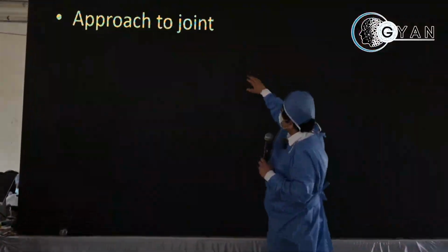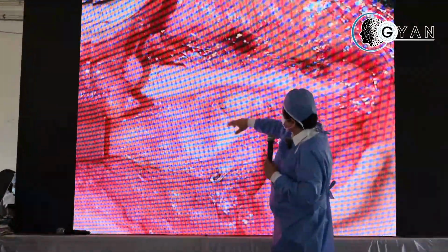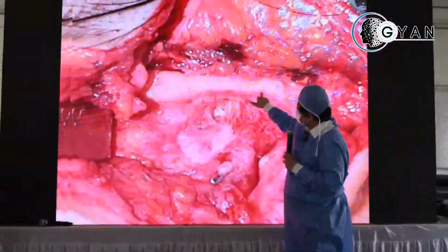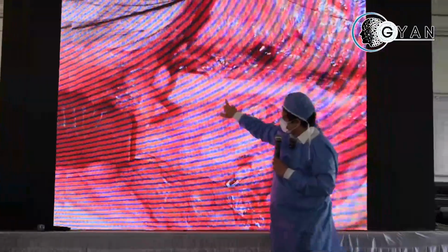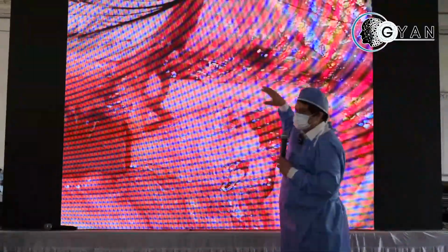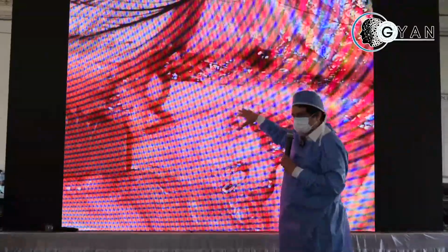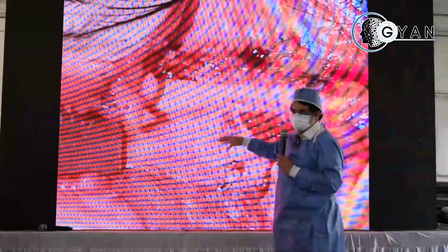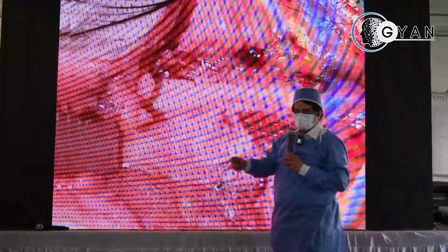So in this you can see the movement here. Now it is easy. Along with the arch, this is the glenoid fossa and this is the eminence. So you have to give the incision and you will directly enter into the superior joint space. In the superior joint space, if the disc is not damaged, it will be very easy to identify the disc because this is a soft, white and thick layer.